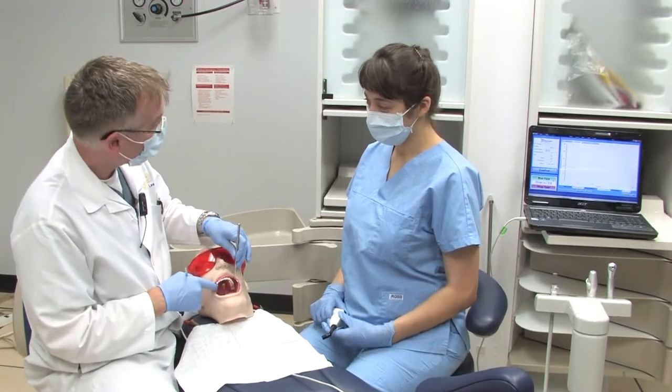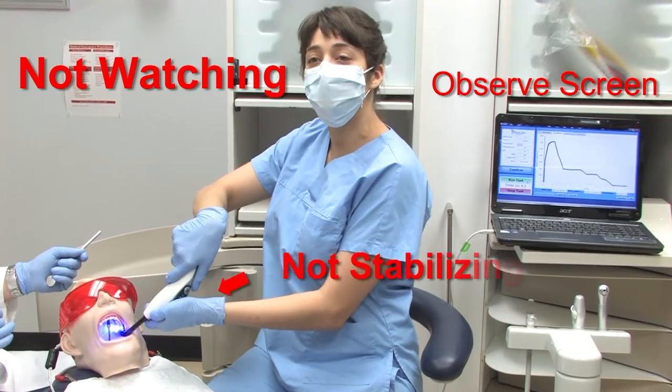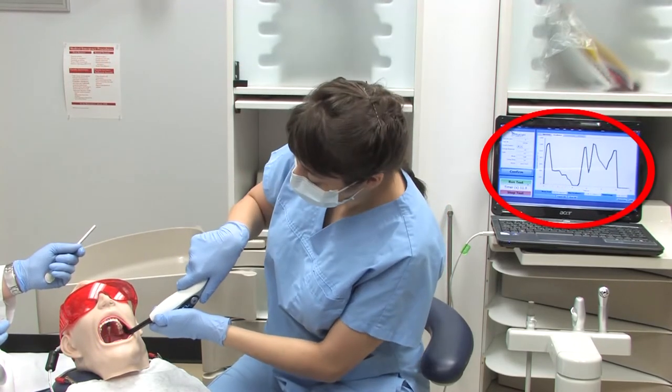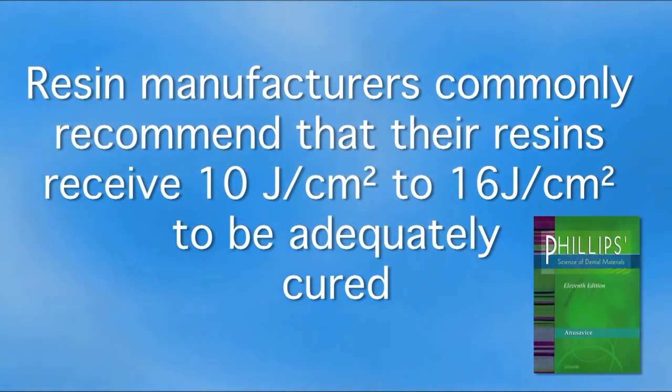Sonia is asked to cure tooth number 27. Mid-procedure, she is interrupted and called to help with an impression next door. As a result of this distraction, she only delivered 6.2 joules per centimeter squared of energy. Dental resins commonly require between 10 to 16 joules per centimeter squared to be adequately cured, and the Phillips textbook recommends 16 joules per centimeter squared.